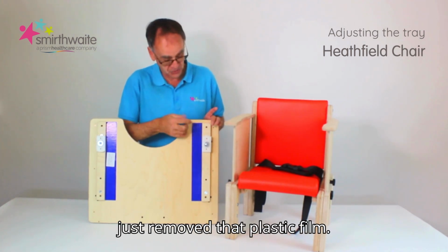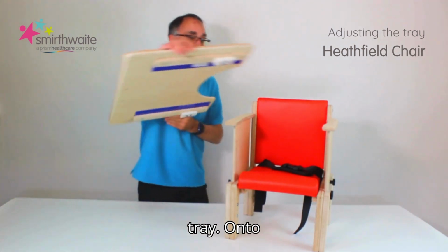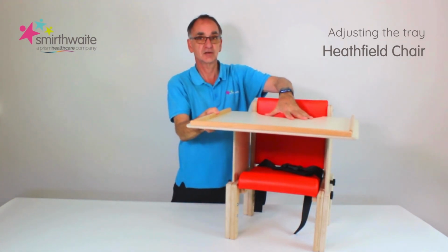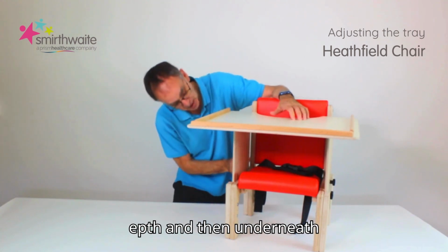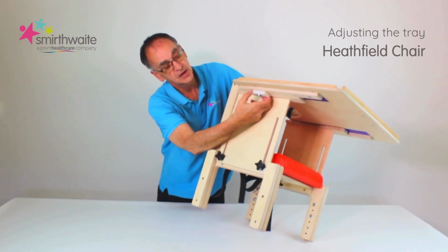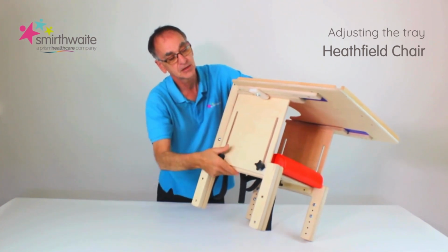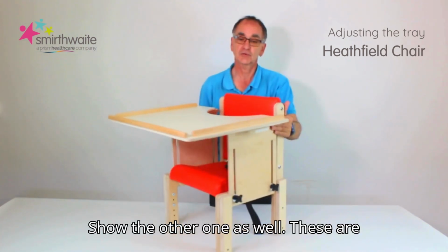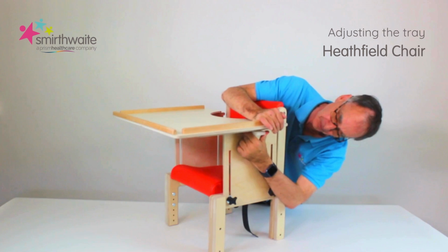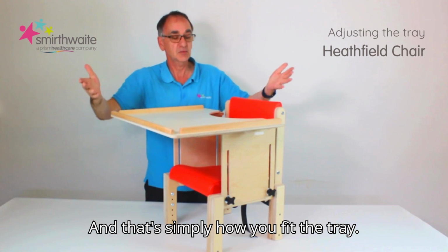So let's imagine that I've just removed that plastic film. The next thing to do is simply place the tray onto the arms at the desired depth, and then underneath we have some clips that will hold the tray in place. These simply just rotate. I'll show you the other one as well. These rotate into position, and now the tray is nice and firm, and that's simply how you fit the tray.